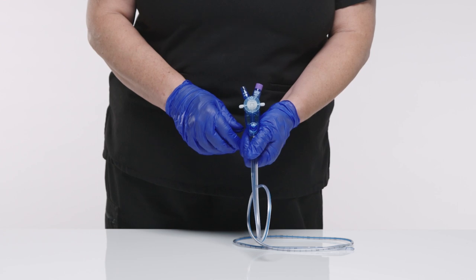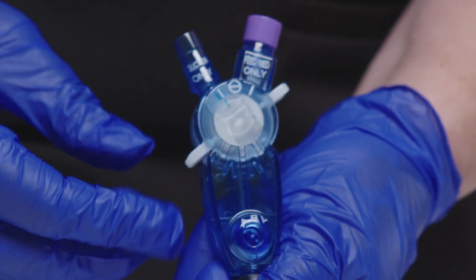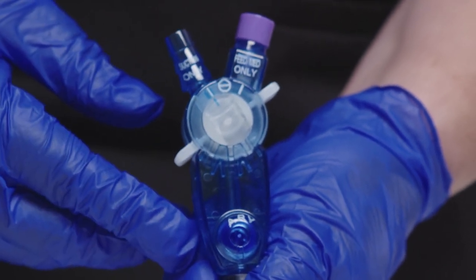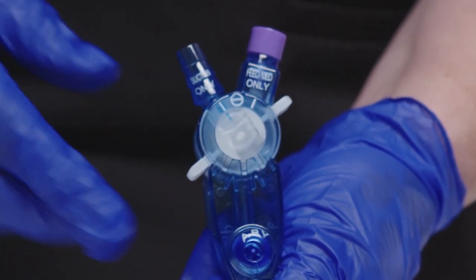Using a quarter twist, securely push the suction line over the port. Turn the selection knob until the indicator line on the knob is aligned with the indicator of the feed port and begin suctioning.